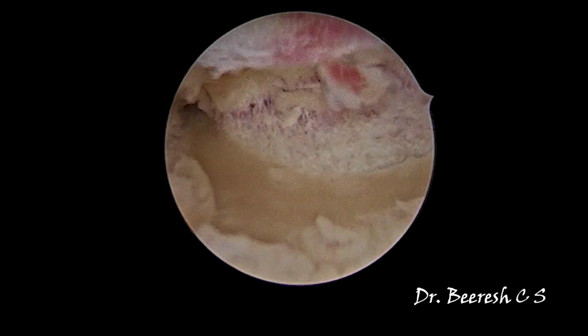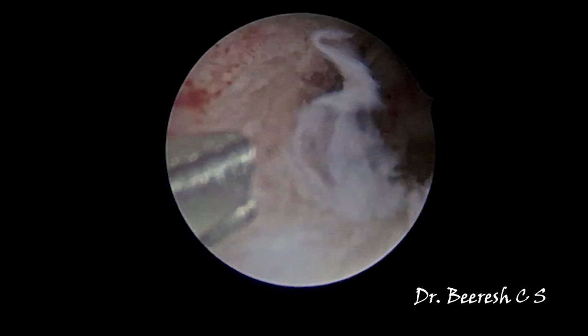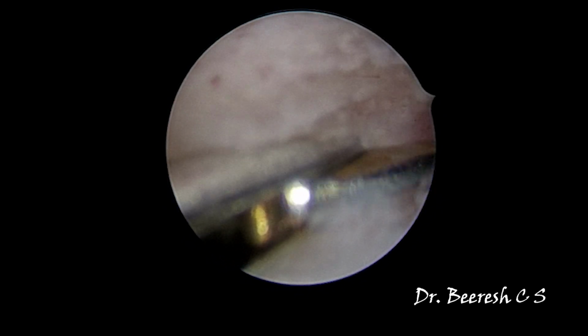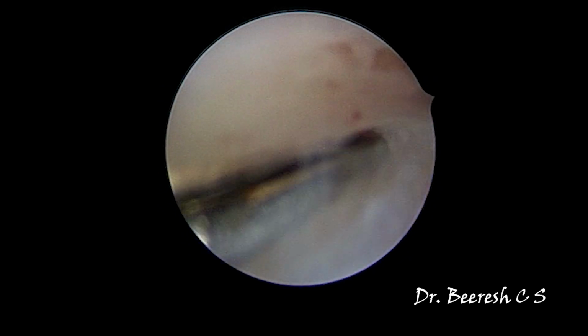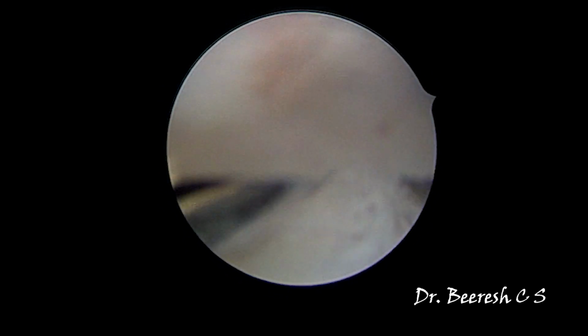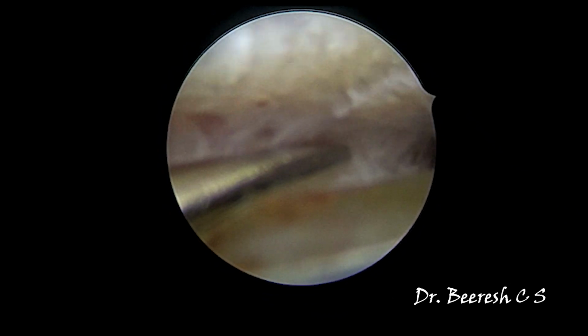Now the remaining endometrium shows the initial size of the cavity. With both fundal and lateral metroplasty, you can see the augmentation of the cavity that has been achieved.